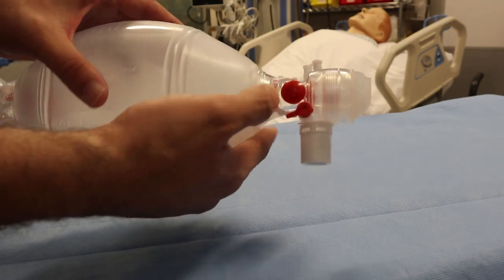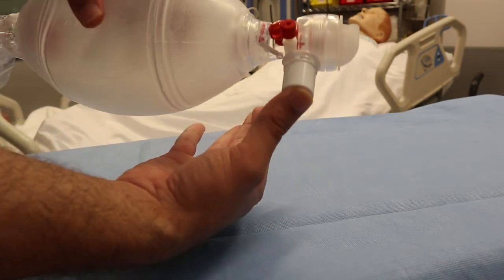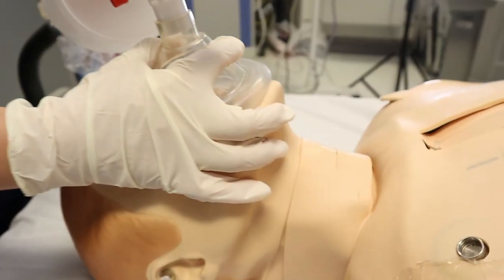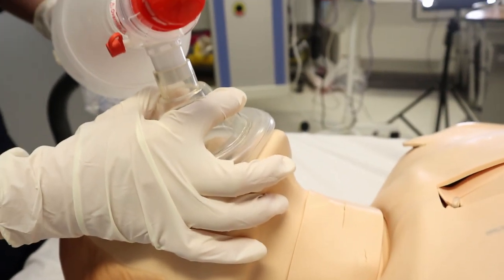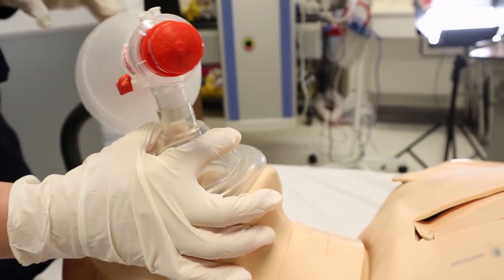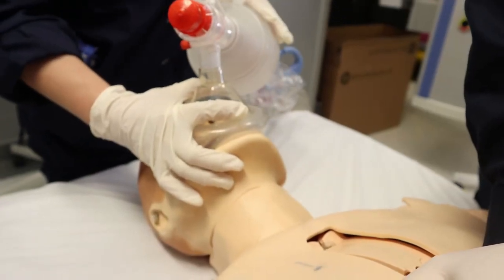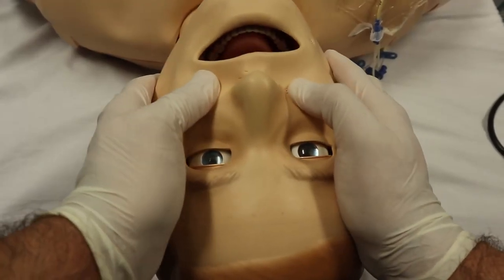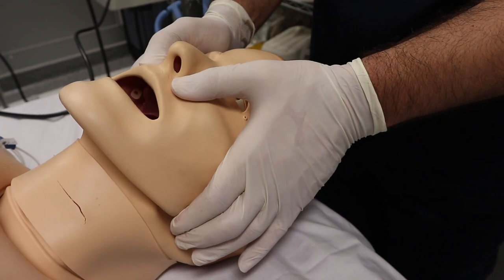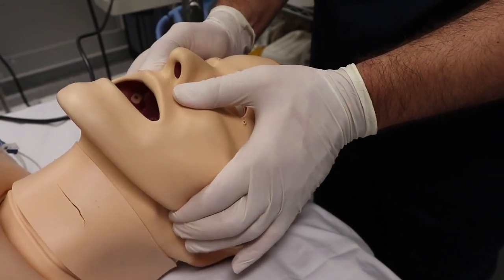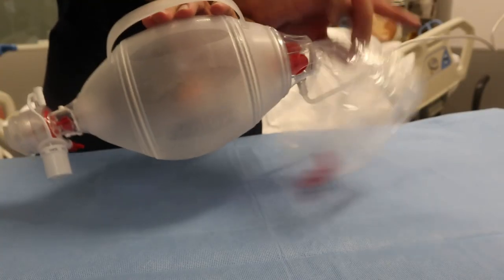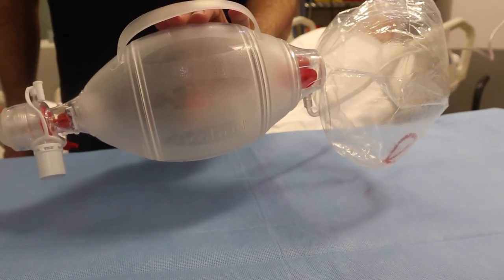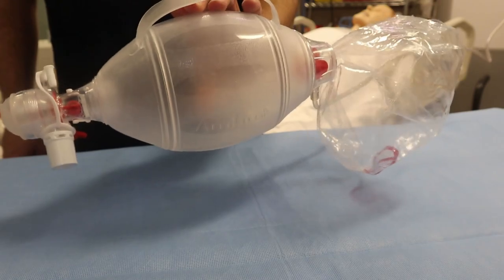Now let's do a straight bagging. You need to place the patient in supine position, open the patient's airway by using the head tilt chin lift maneuver. If cervical spine injury is suspected, use a jaw thrust maneuver without extending the neck. Using the bag mask valve with oxygen reservoir, it will give really high concentrated oxygen to the patient. Ensure that the mask is large enough to seal around the patient's mouth and nose without covering the eyes.